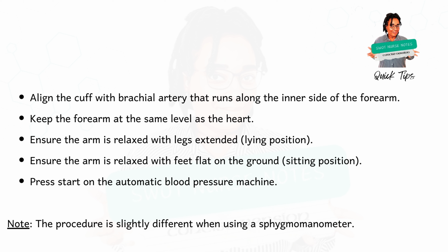Press start on the automatic blood pressure machine. Please note that the procedure is slightly different when using a sphygmomanometer.